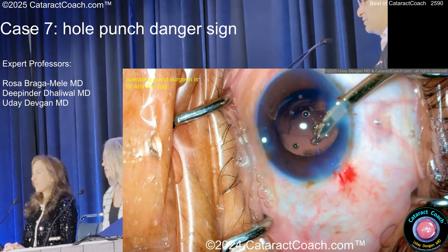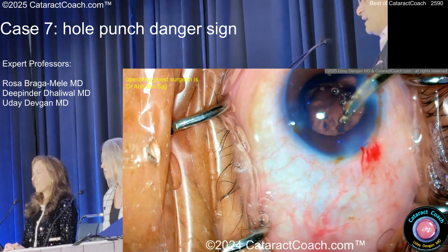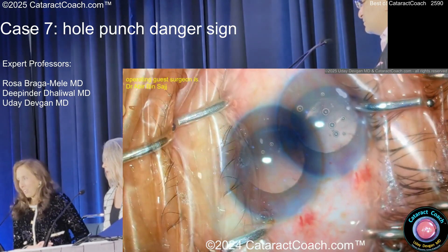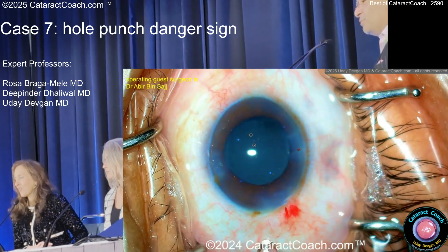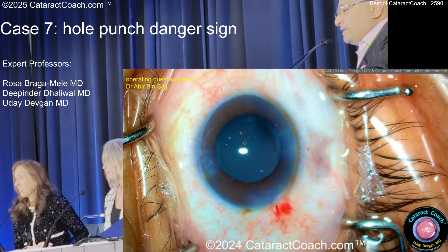Not anymore though. You guys ever use a Simcoe cannula? Great control. There's the triamcinolone — now it looks like a good, clean anterior segment. That looks pretty reasonable.